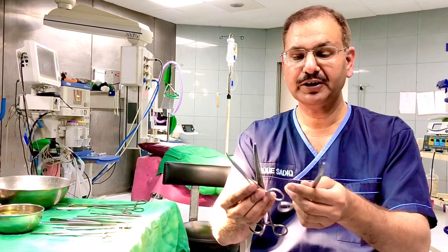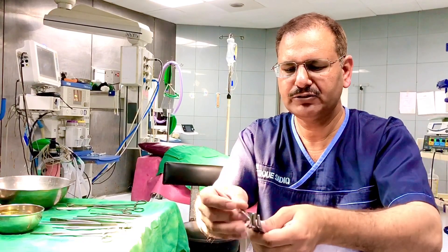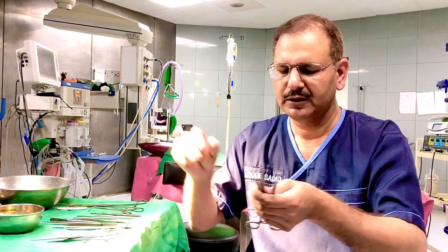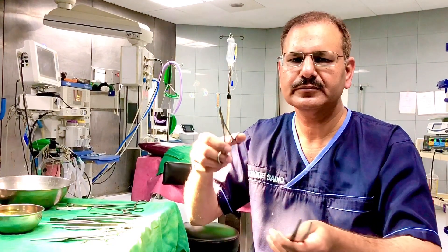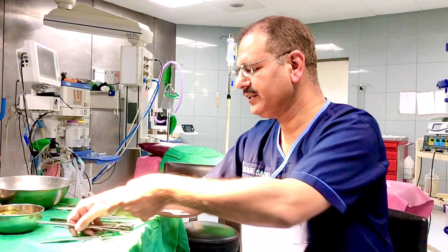Then there are curved artery forceps — these are the same as straight artery forceps but curved. Structurally they are the same; the corrugations are the same. They are used to hold bleeding points, as arteries are bleeding points.